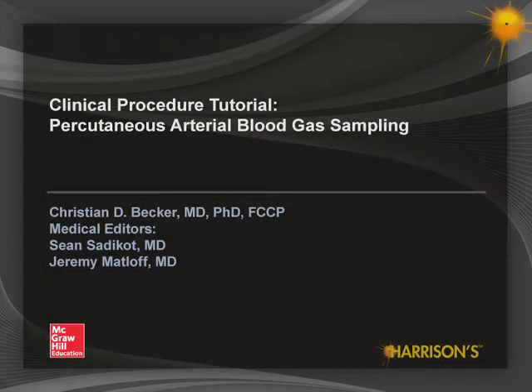I'm Dr. Christian Becker from Mount Sinai Medical Center in New York. This instructional video will review the indications, contraindications, techniques, and potential complications in the performance of percutaneous arterial blood gas sampling.